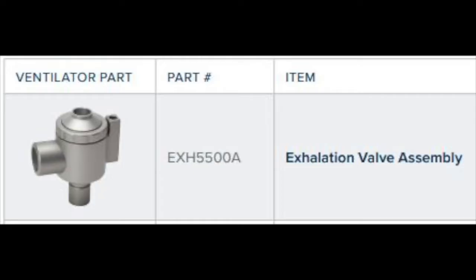Now let's just say that you performed the 2-year PM and you changed out the components on the inspiratory side, or you do not know where the leak is. So you want to perform the system leak check to isolate which side the leak's on.